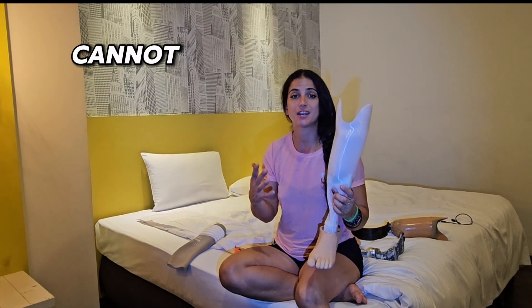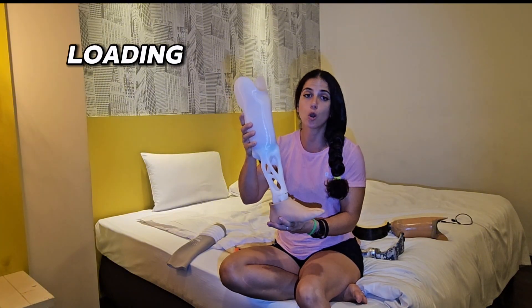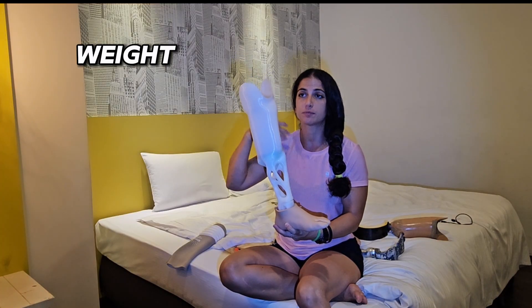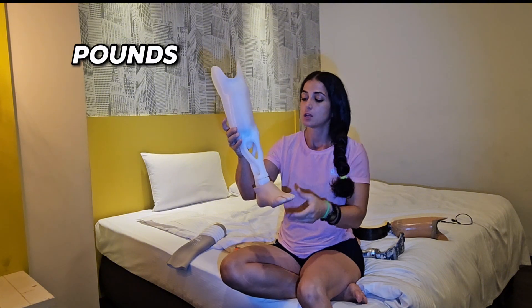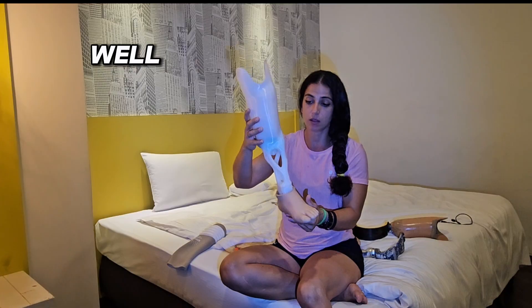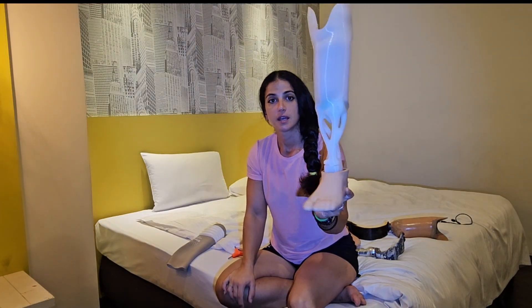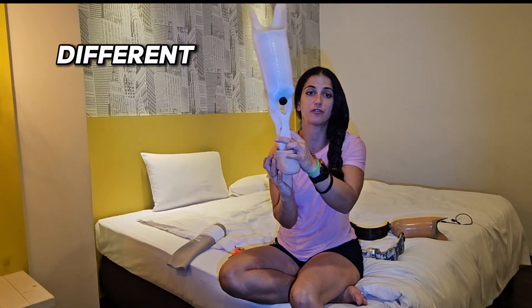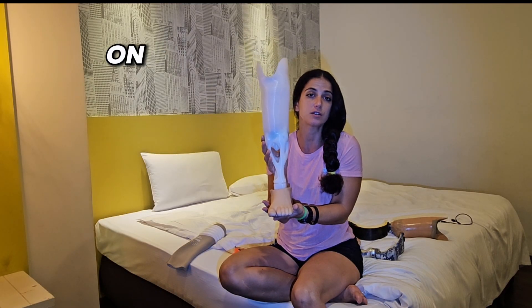This is also for walking, and I usually work out with this one too. But I cannot lift a lot of weight because this leg also has a loading limit — it cannot exceed my weight plus about 20 to 25 pounds. So I have to be careful. But overall, it's a uni leg — just one piece, very light, cool, and a very different design.